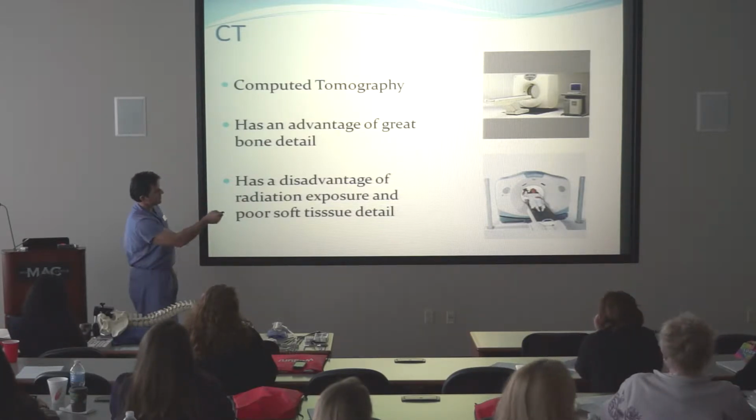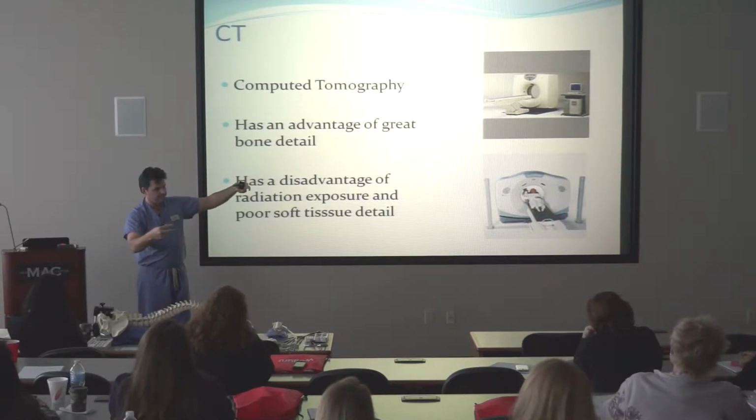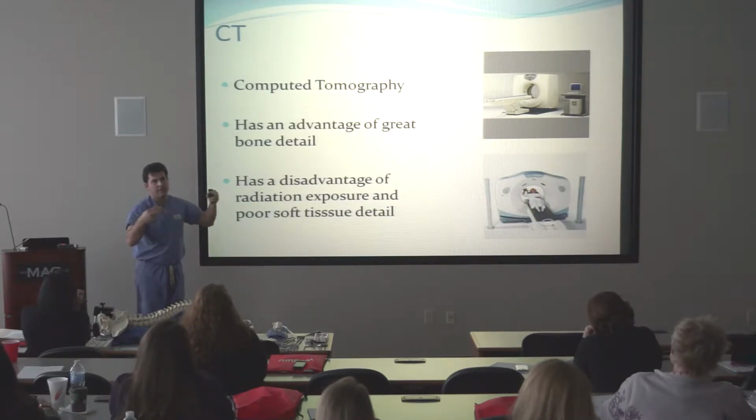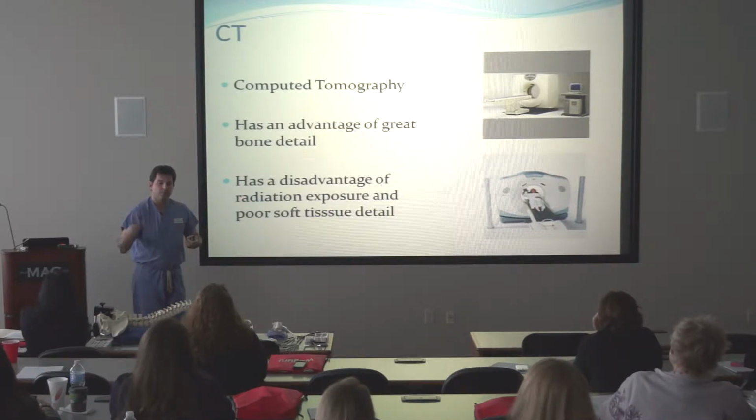Then the sensor that's on the other side of the X-ray, so this thing is spinning around like this and keeps going around, where you have an emitter and a receiver over here as far as the X-rays, and then those signals of the radiation that gets picked up by the receiver gets sent to a computer. The computer then picks up the different densities and how much density there is on these different X-rays.